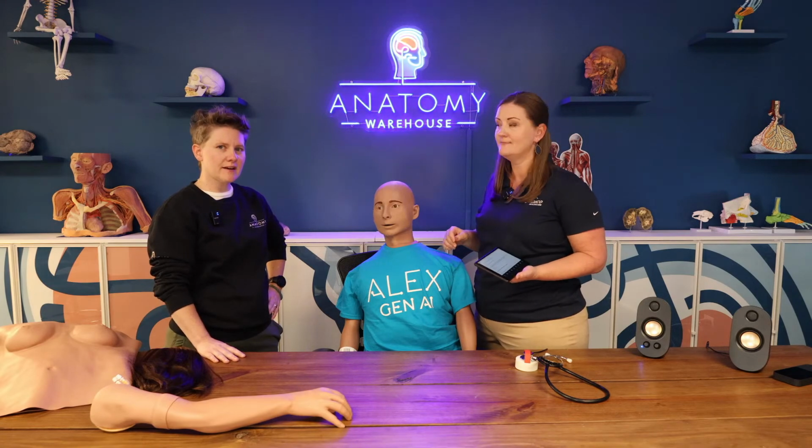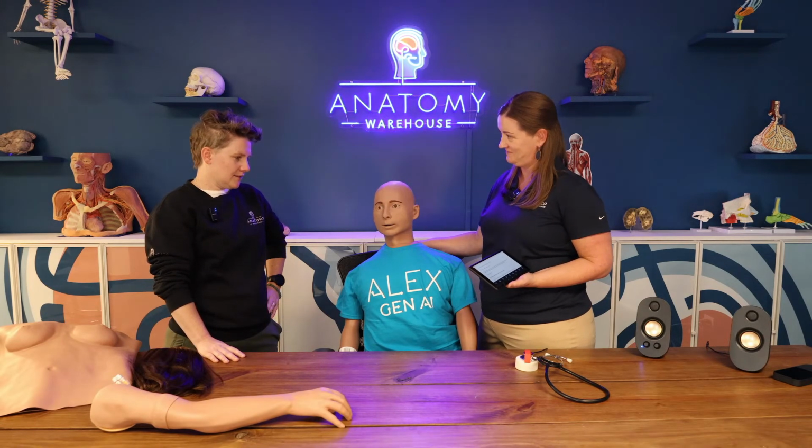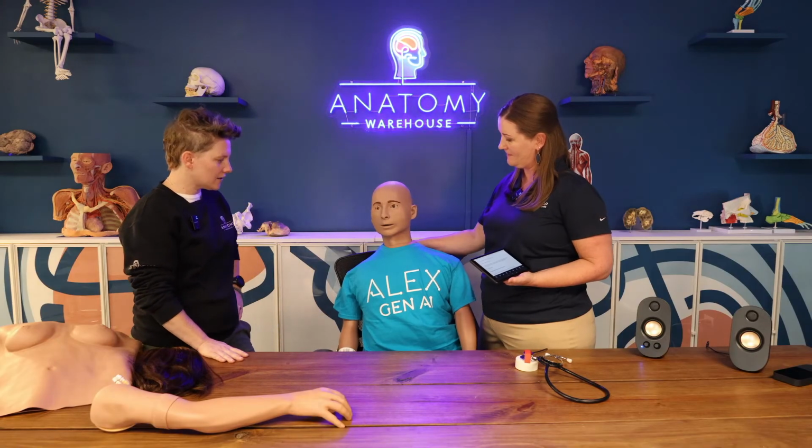Super immersive. I love that. Yeah, it works out pretty nice. All right. Is there anything else that we should know about Alex?